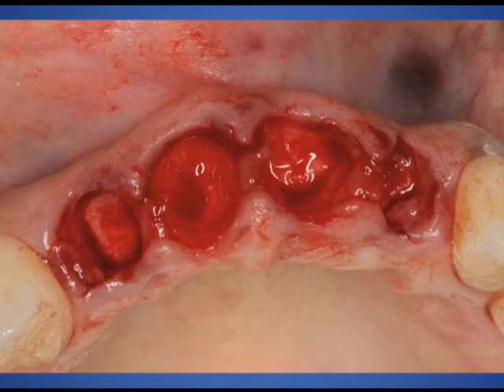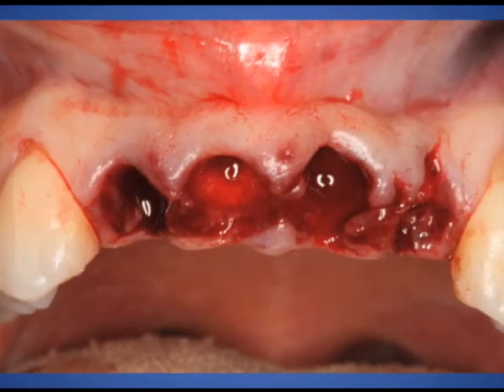Nice, clean extraction. And you can see after the extraction we have a viable bone to work with, very shallow socket sites, so I feel very comfortable in the placement of our dental implants. We have pretty good width also because it's an immediate extraction situation. The buccal plate is really intact and should turn out to be a nice situation for us. Interdental papilla, trying to maintain those triangles as much as possible, is a critical part in the final aesthetics for this patient.